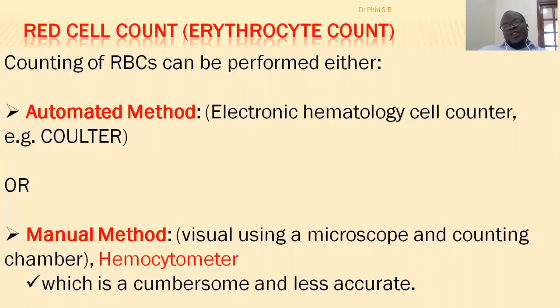So now you know the functions of red blood cells. The next thing you need to know is how to do red cell counts. So red cell count is also called erythrocyte count.